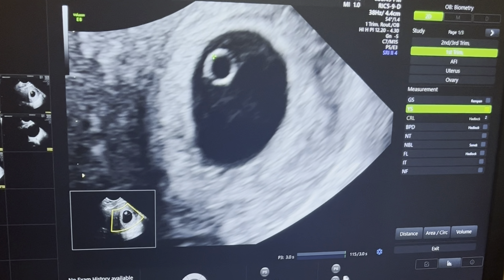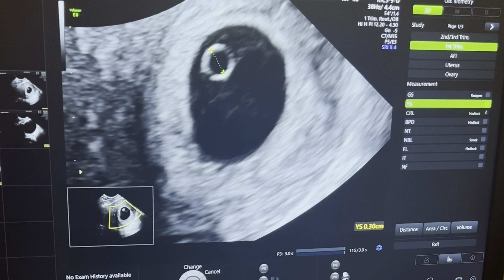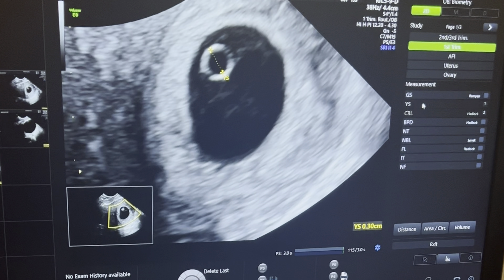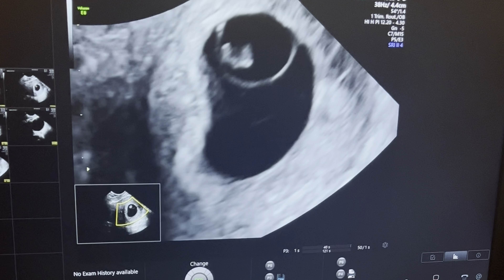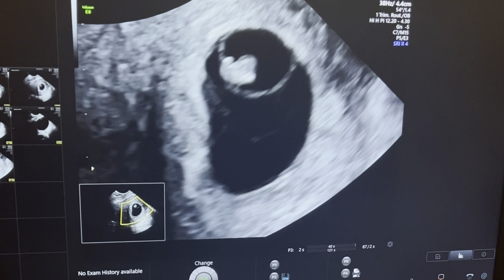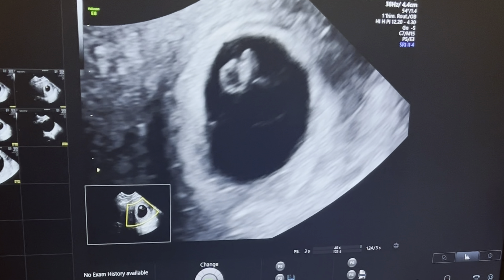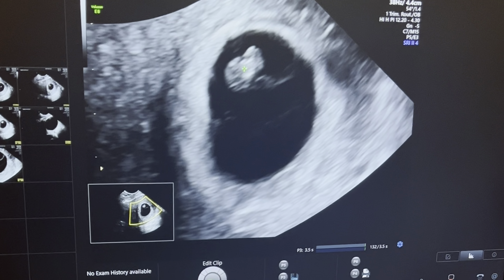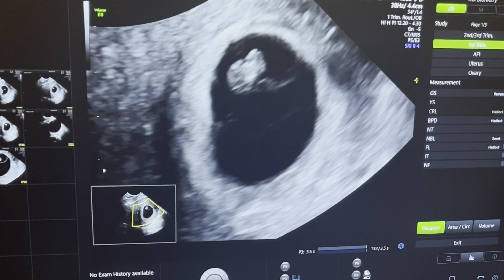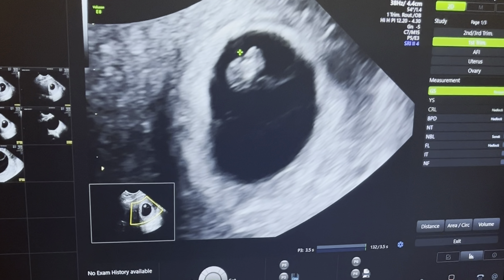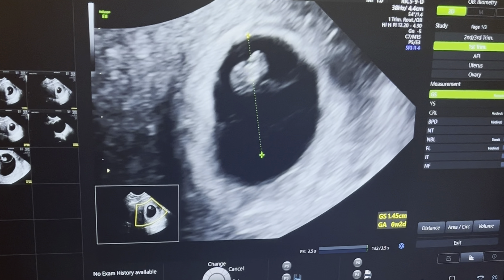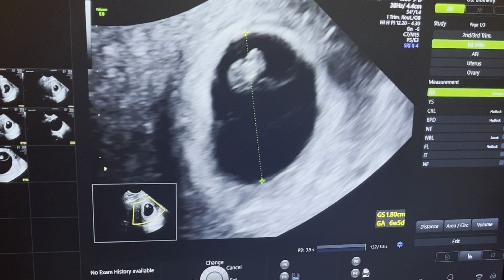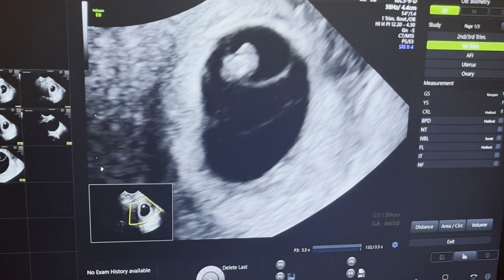To measure the yolk sac, bring the yolk sac to the center of the screen and measure it inner to inner. The yolk sac is about four millimeters. Then measure the gestational sac diameter, which is again corresponding to around six weeks and five days.